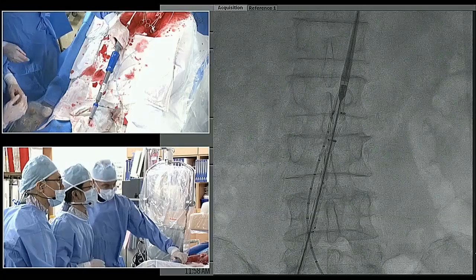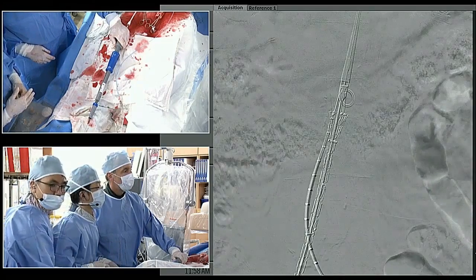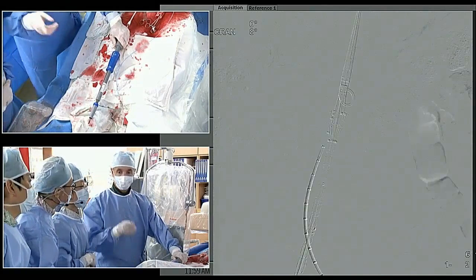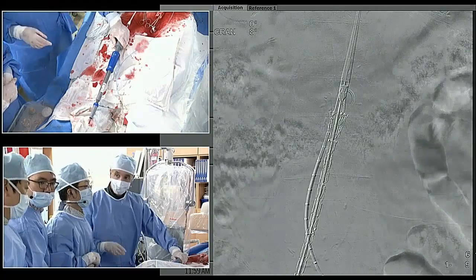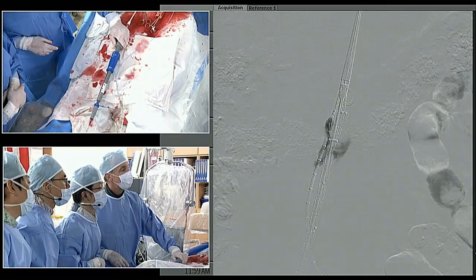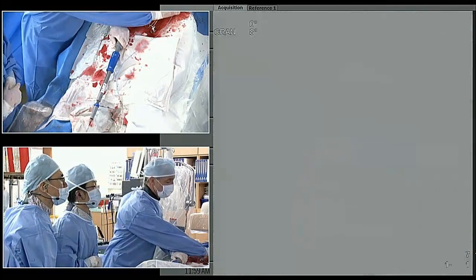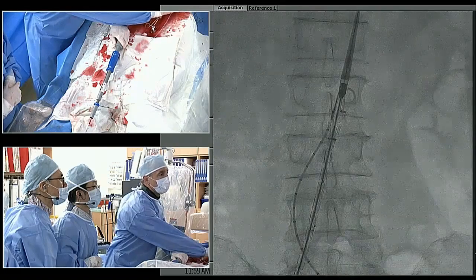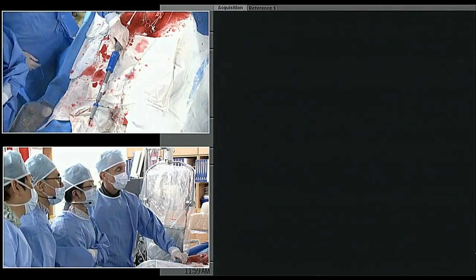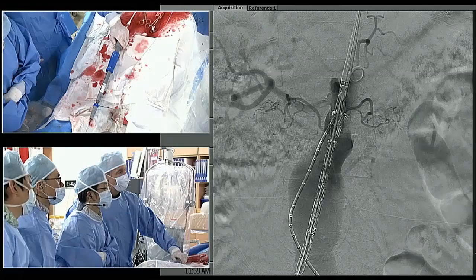Is there any posterior angulation of aorta neck on CT scan? No, not really. It's pretty straight. Are you ready? Ready. Yeah, it's not filling. The pigtail's a little too low. Yeah. The other thing I use is a straight angiographic flush of 5 French so it doesn't get entangled and it fills laterally rather than inferiorly.